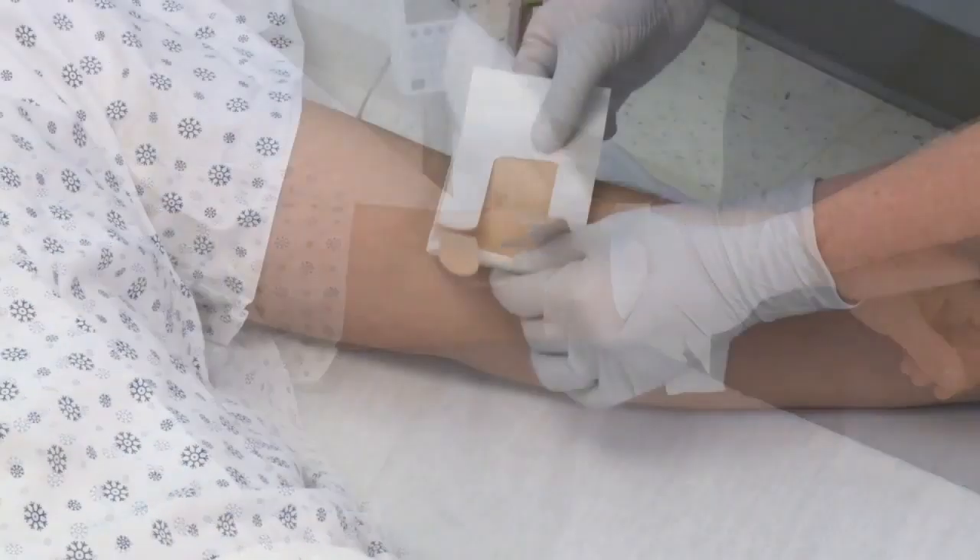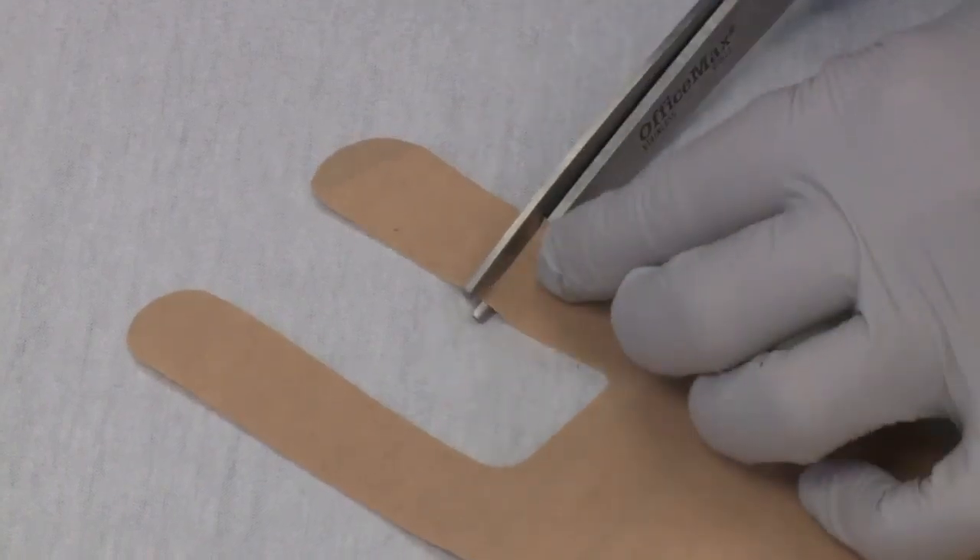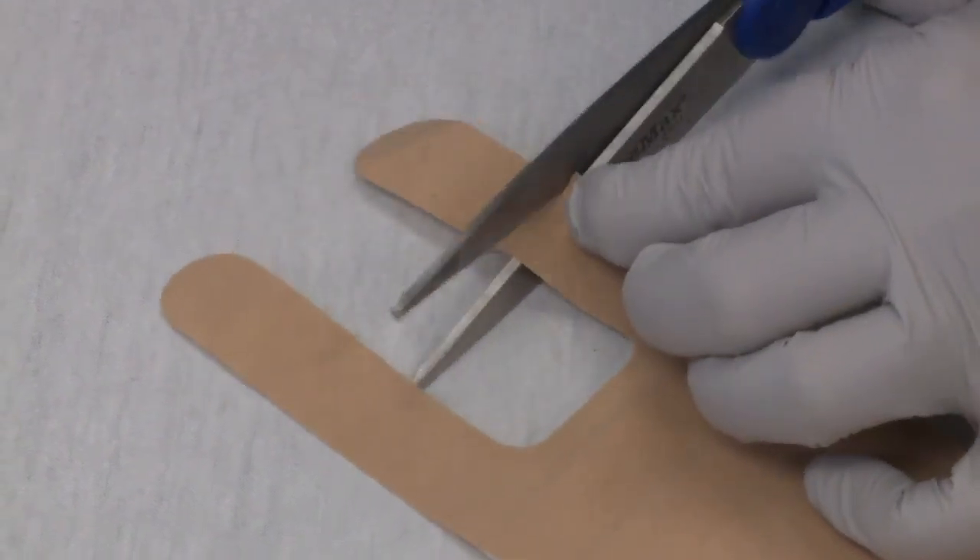Next, center the pad over the IV and dressing and determine if the length of the legs need to be shortened to prevent overlapping. If necessary, cut the legs before removing the liner.